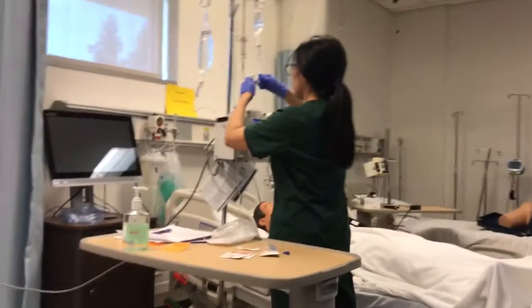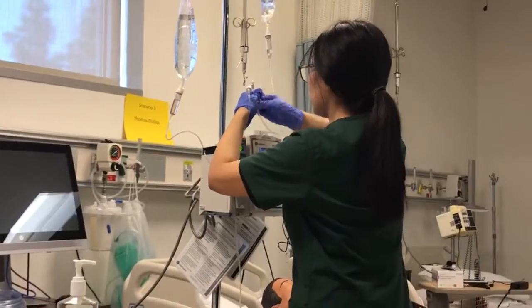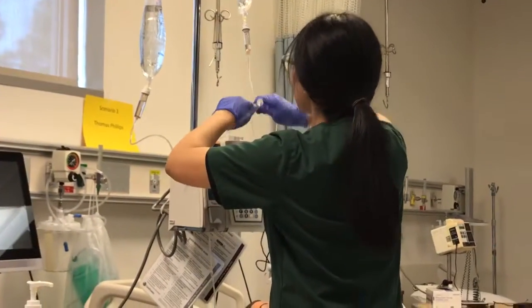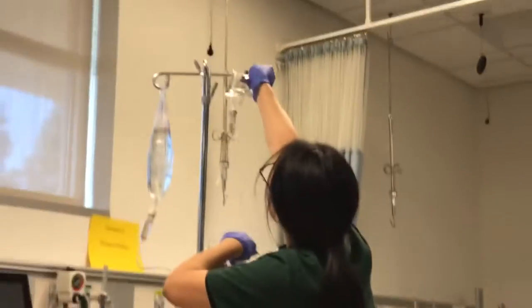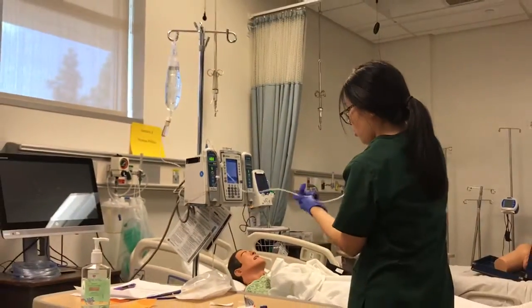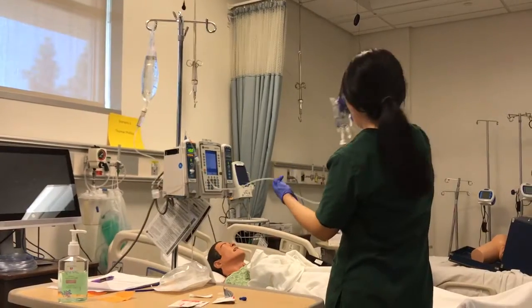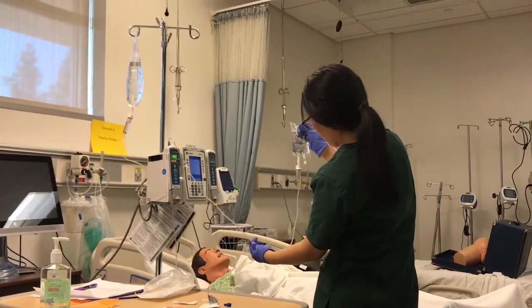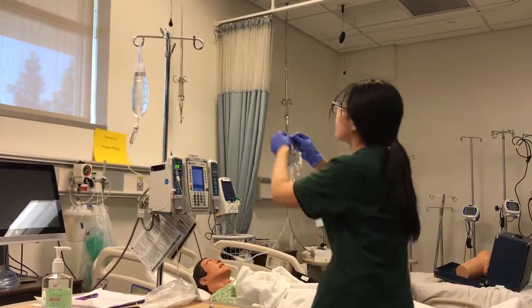Go ahead and remove the secondary cap. Connect these two. Then I will do the back priming here. Make sure there's no air bubble. I will open the clamp, and that's the primary workflow here. Okay, now it's all bubble free.